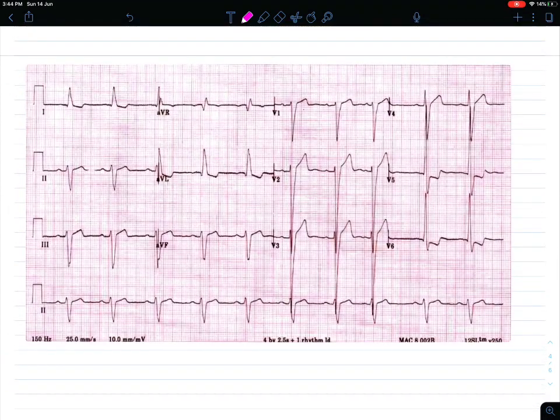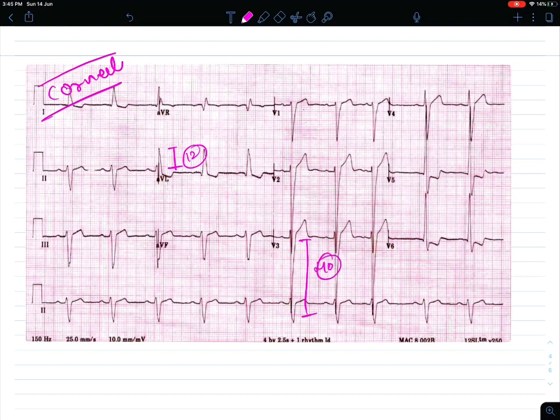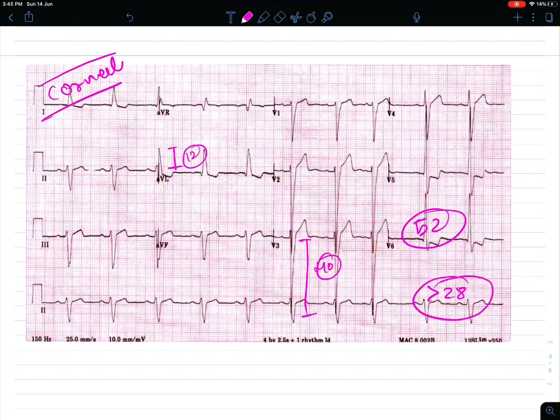Let's see one more example. We will apply Cornell voltage criteria. In this we have to consider R wave in AVL and S wave in V3. The R wave in AVL has around 12 small boxes and S wave in V3 has around 40 small boxes. It comes to around 52. According to our criteria it should be more than 28 small boxes, so it suggests LVH.